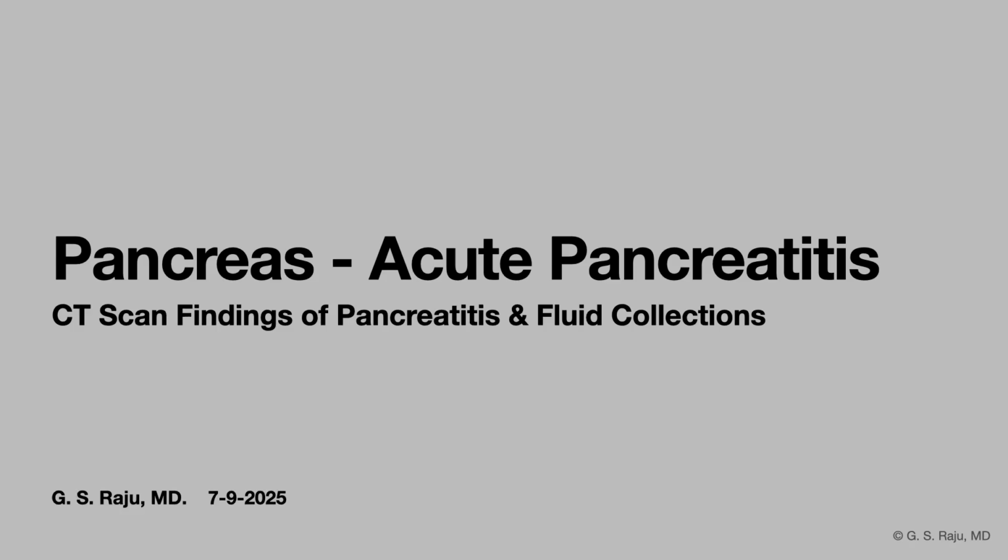Greetings. Let us learn about how you evaluate acute pancreatitis by looking at the CT scan. This is very important to manage a patient coming in with acute pancreatitis.